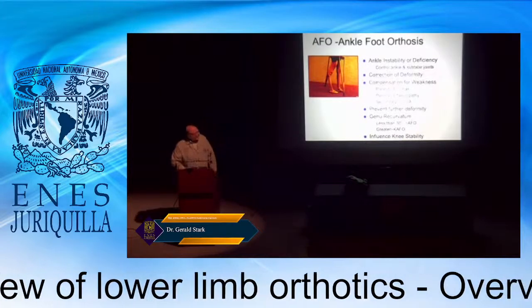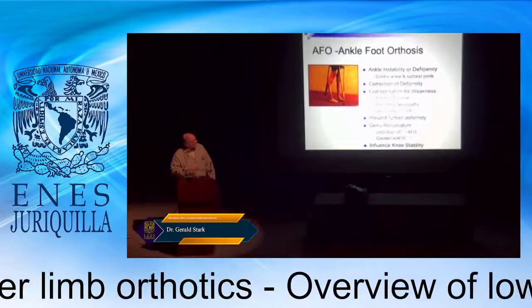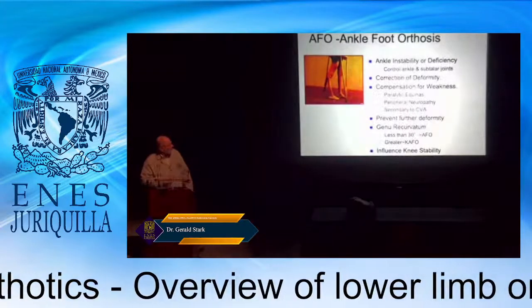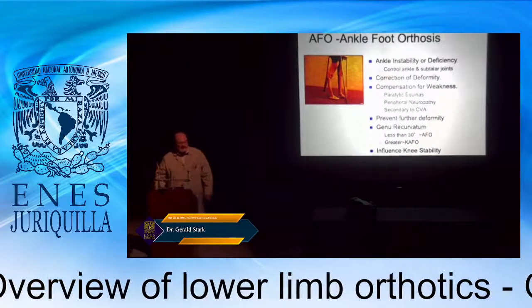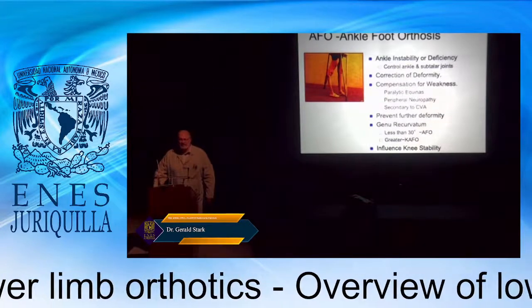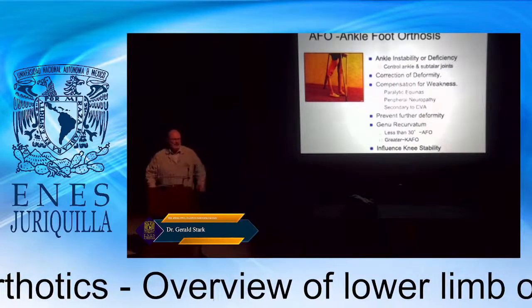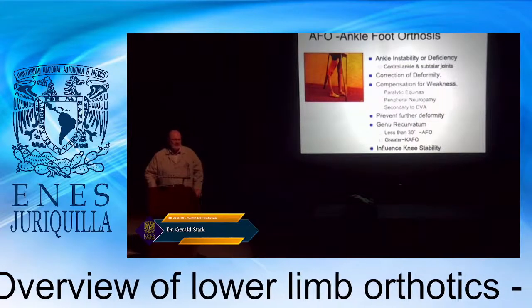An ankle foot orthosis is really for ankle instability or deficiency. And again, the main goal is correction of the deformity, the position of the tibia, and to compensate for weakness. Now, typically we see this with patients with paralytic equinus. I'm not sure how it's said in Spanish, Español, but we would say drop foot, right? And drop foot is one of the oldest pathologies described.